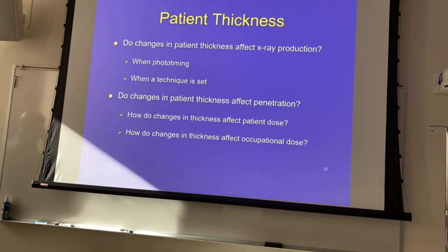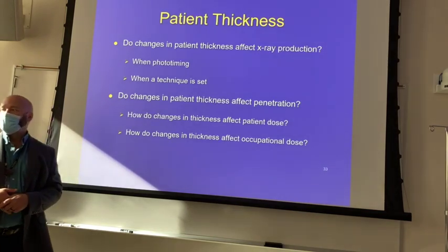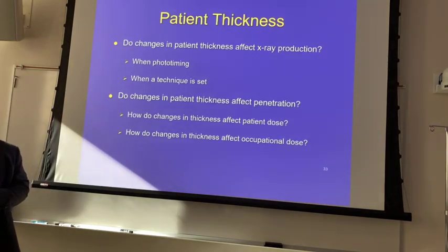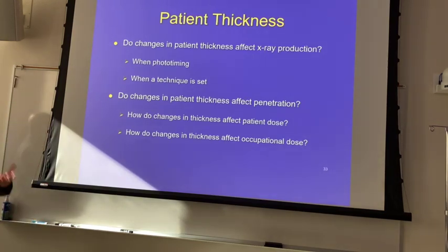What if you're fluoroing? You have to be in the room when you're fluoroing most of the time, right? So what are you going to do? That's number one. Wear lead. What's that? Step back. Get behind somebody, right? Remember, you're not making all this money in clinicals to get exposed, right?